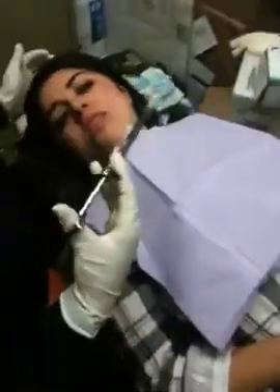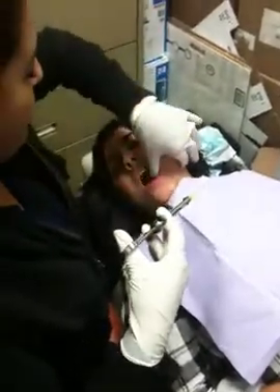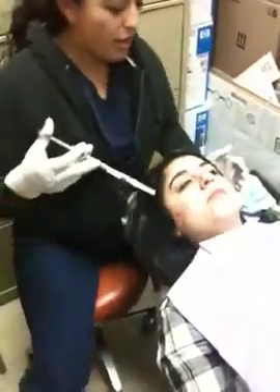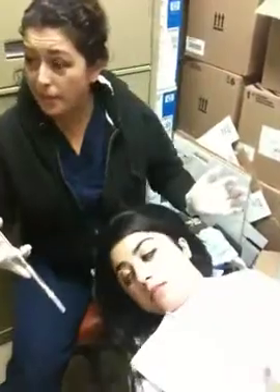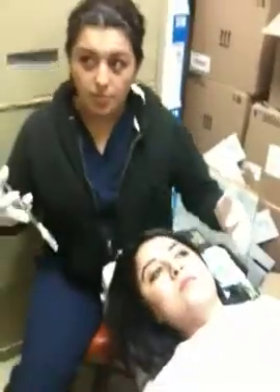On the mandible — do a lower. Now you're going to be doing the mandible. All the way on the other side — have you come behind the patient? Behind the patient, when you do the mandible. Same side. If you're doing the left side, same side. No, do it from the same side. If you're doing the lower left.